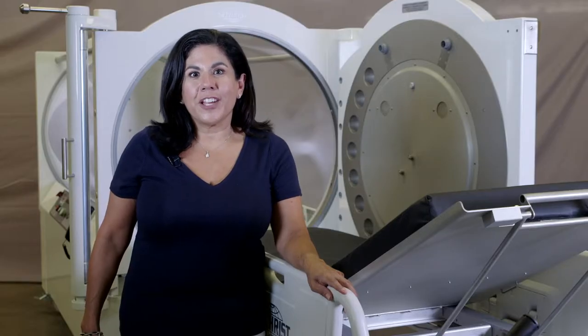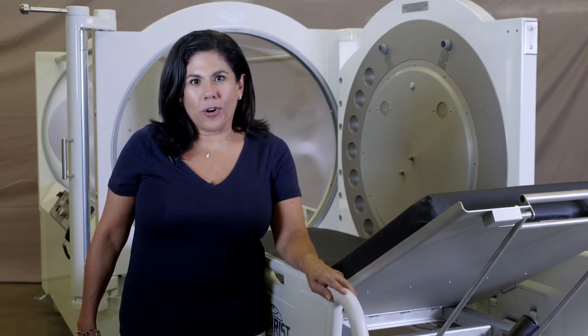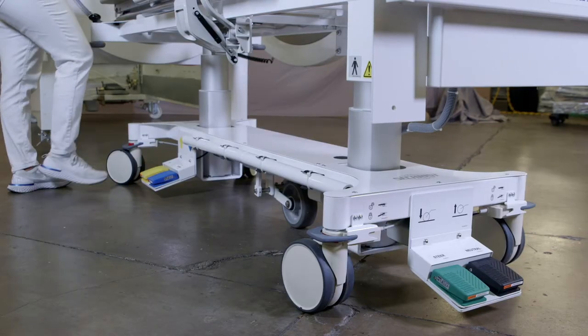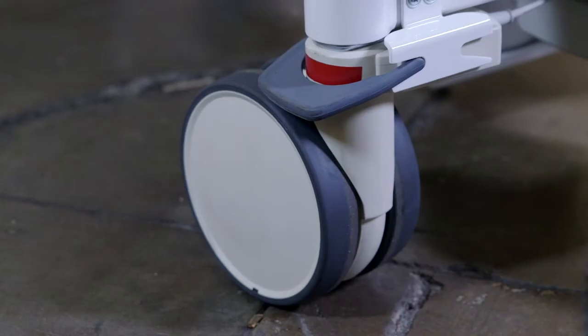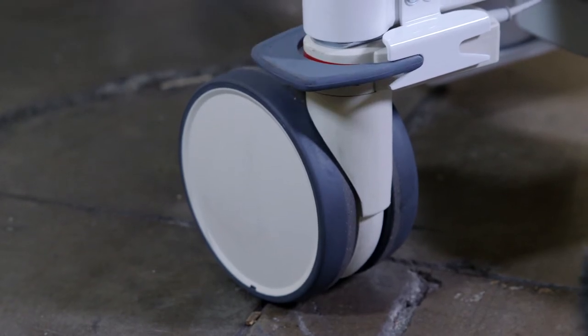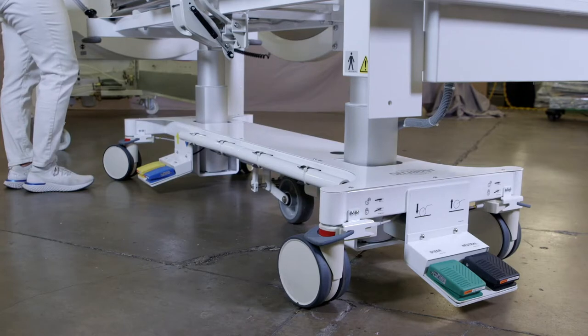For ease of customer use, our team developed a four caster braking system. This system easily allows the user to activate the brakes on all four corners with one gentle touch of a gray paddle. One step of the gray paddle and all of the casters lock or unlock simultaneously. In the locked position, you'll notice that you can see the red tape. This signifies that all of the gurney casters are locked and you're now ready to load and unload your patient.